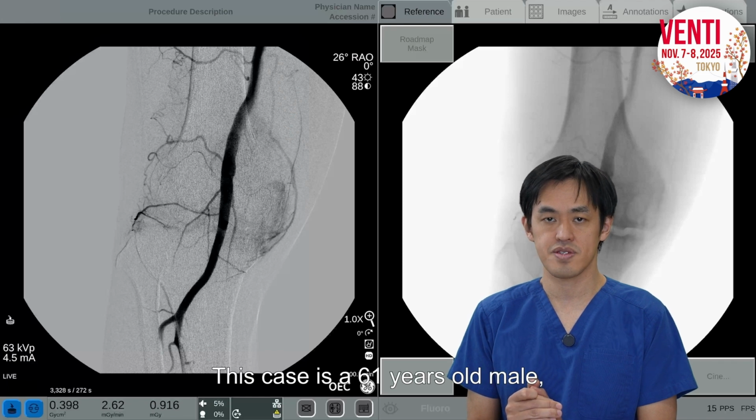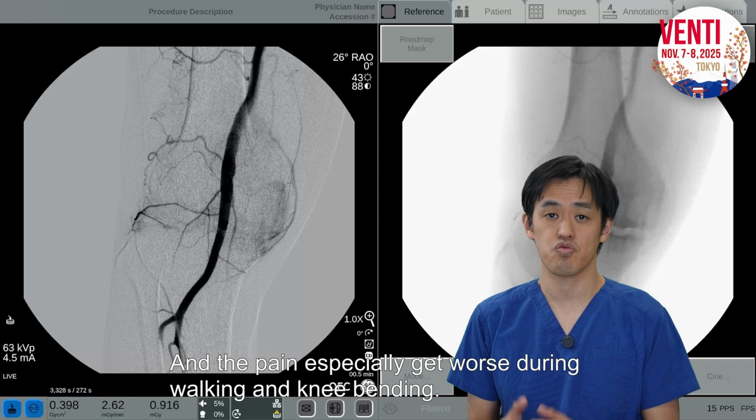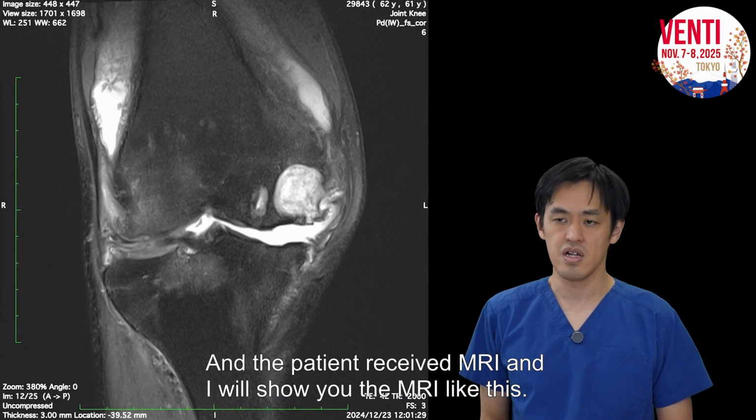This case is a 61-year-old male who has a several-year history of right knee pain, and the pain especially gets worse during walking and knee bending. The patient received an MRI, and I will show you the MRI like this.